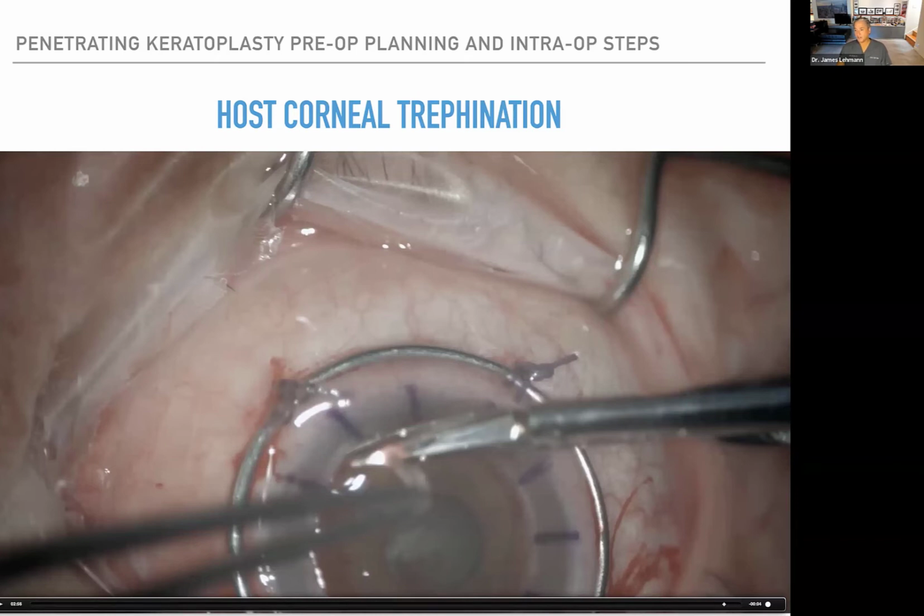Dr. Indri Wahayuni asks, what is your choice, cataract surgery with PK, 1 step or 2 steps? We kind of covered that before, but if it's a mild to moderate cataract, I like to do the PK first. If it's severe, I like to do it with the PK.